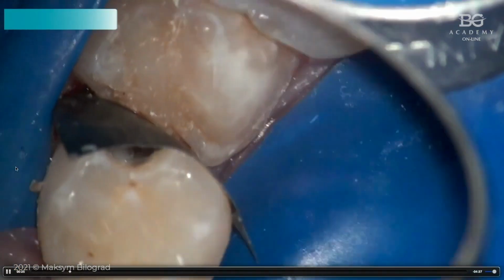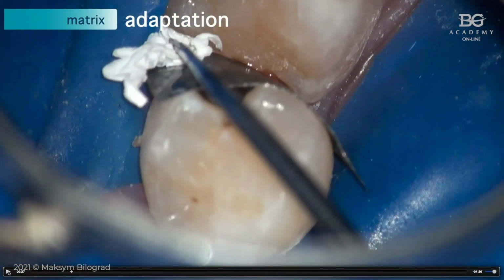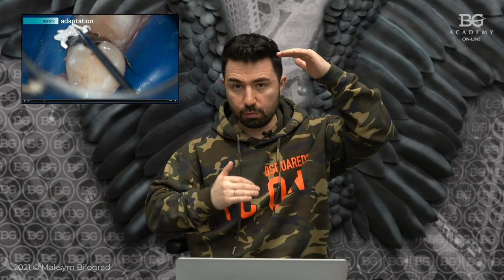Another thing that I would like to point your attention to is the matrix. I tried many standard matrices and they were inefficient because the level of soft tissues from the vestibular and lingual sides was way higher than from the distal. The difference was huge.